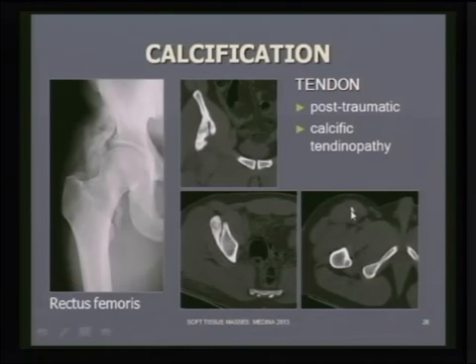So the diagnosis here is really made by looking at its anatomical location of the ossification and the calcification and locating it to the site of a known major tendon.